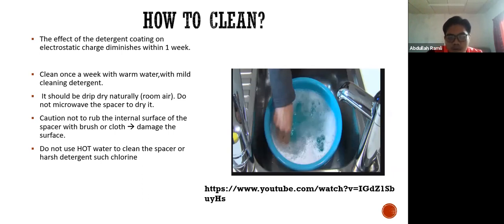And do not microwave the spacer to dry it. We need to be cautious not to rub the internal surface of the spacer with a brush or cloth, as it may damage the surface. It will reduce the efficiency of the drug delivery. And then do not use hot water to clean the spacer or harsh detergents such as chlorine.